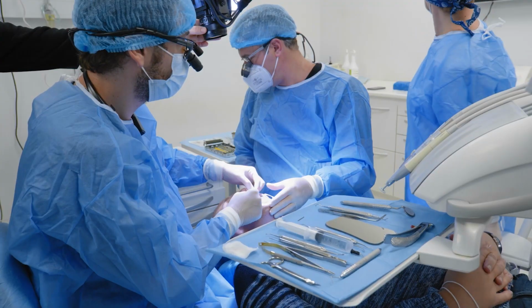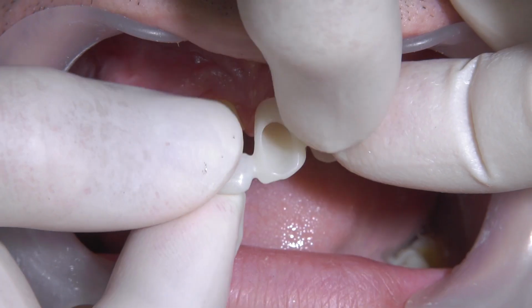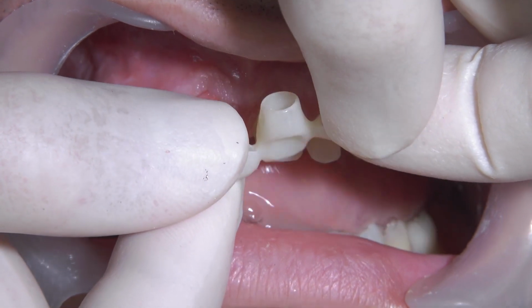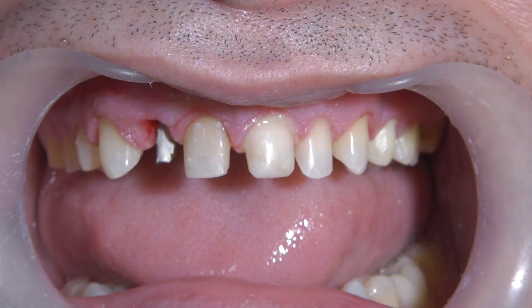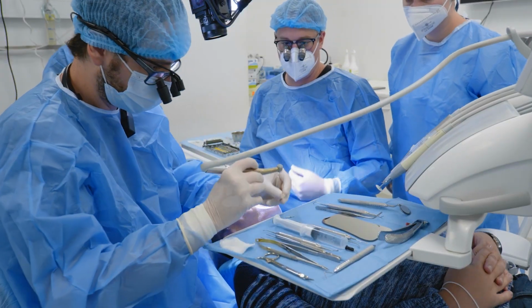One step also that we really want to do is create some small retentions inside. So we just take a small burr, and we create some small retentions.